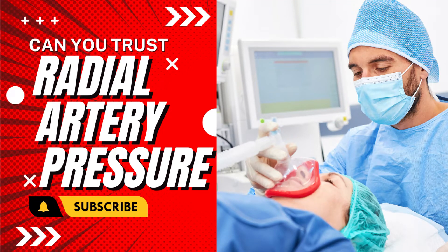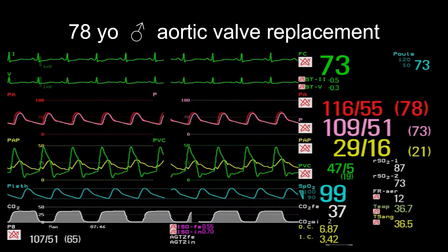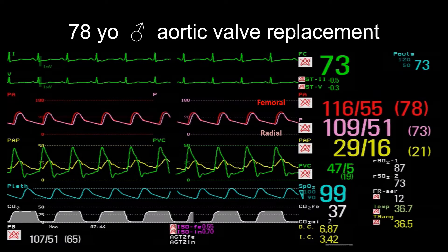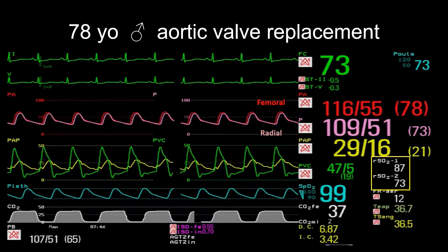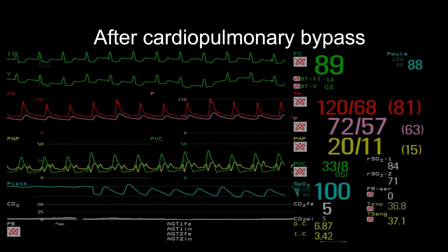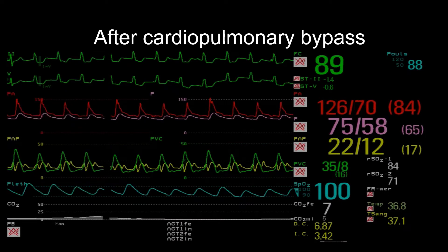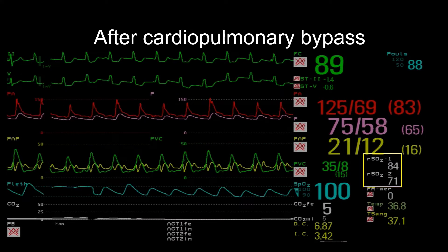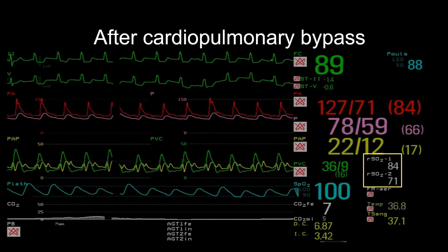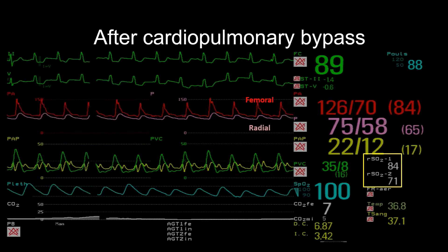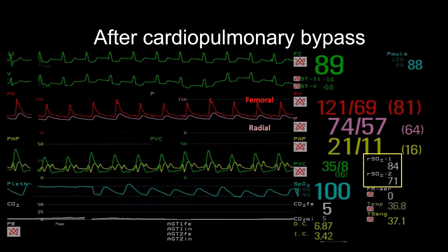Can you trust the radial artery pressure? A 78-year-old man undergoing aortic valve replacement. This is the femoral in red and the radial in pink. Note these are the somatic saturations, which are normal. After cardiopulmonary bypass, the somatic saturations are still normal, but the systolic pressure is 48 mmHg higher than the radial artery pressure.